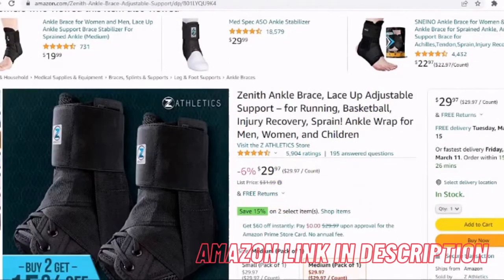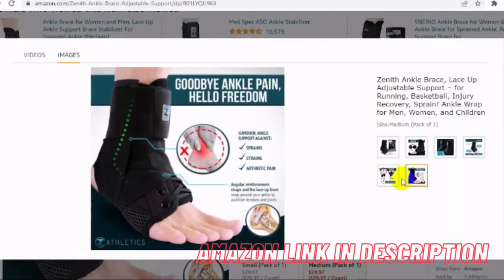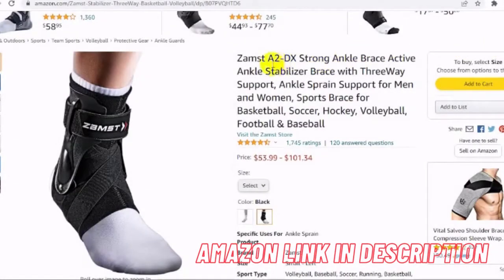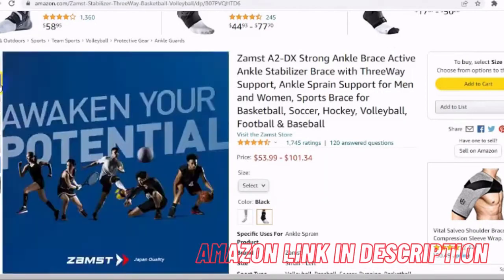Accurate fit: having the right size ankle brace is important to make sure the device functions properly, keeps your ankle secure, and does not move excessively. Our advanced ankle brace is engineered with dual molded exo grid support technology for enhanced medial and lateral stability.